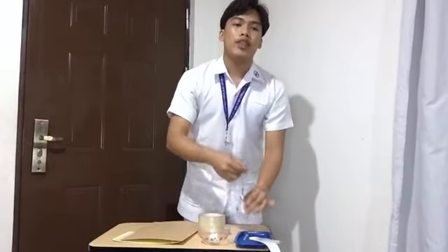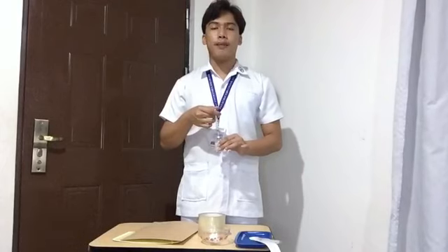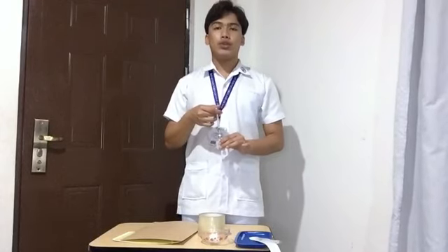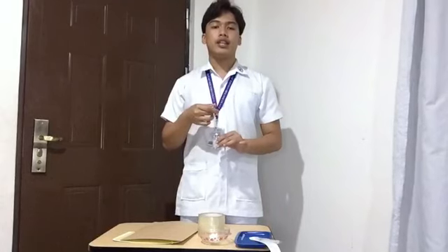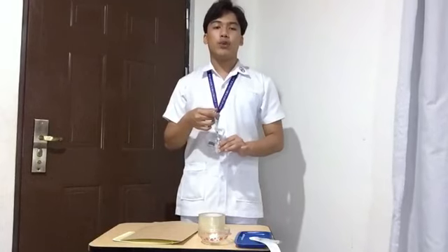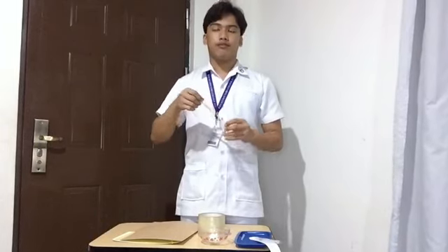Next is withdraw the prescribed amount of the medication using either of the following methods. So I am going to use the second method, which is invert the vial. Ensure the needle tip is below the fluid level and gradually withdraw the medication.